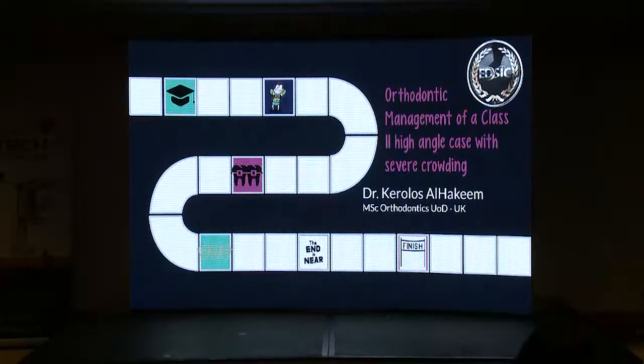You told us that the upper laterals were too small. Yes. Why did we compensate by reshaping the laterals? Yes, it was consulted with the patient, to obtain perfect class 1 canines. Yes, this was discussed with the patient.